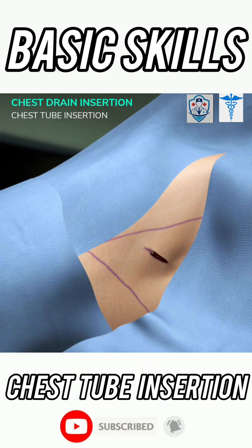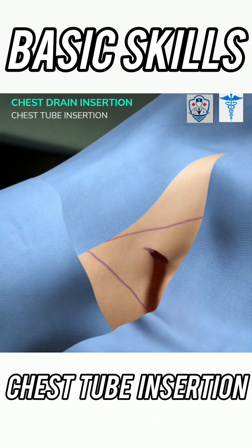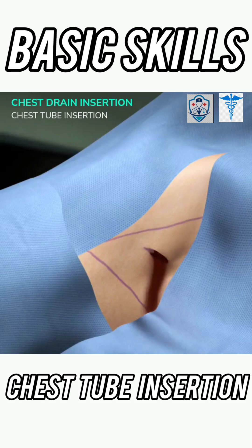Use your gloved finger to ensure the lung is not adhered to the chest wall. If a hemothorax is present, blood will often be seen exiting the wound as well as pleural fluid. This will confirm entry into the pleural space.